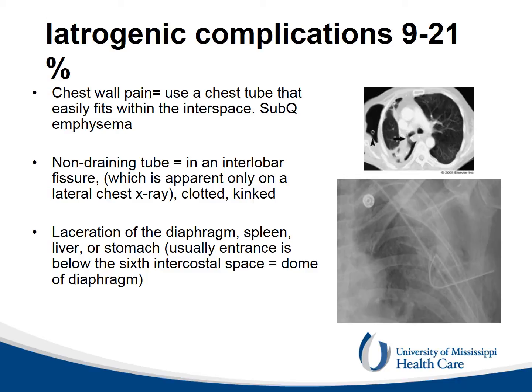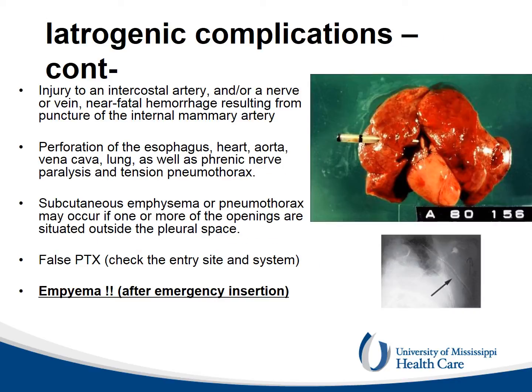They are represented by pain, a non-functional chest tube, or damage to intrathoracic and/or intra-abdominal vessels and organs. Damage to intrathoracic and intra-abdominal organs is possible if the chest tube is advanced forcefully and against resistance. If any resistance is encountered, the chest tube should be pulled back 1 or 2 centimeters.